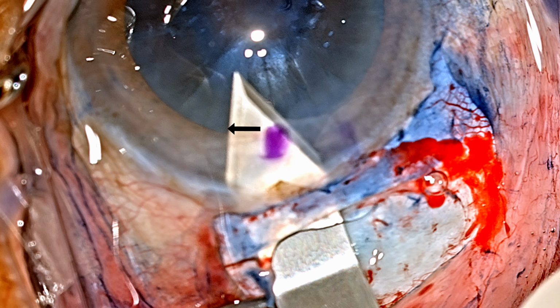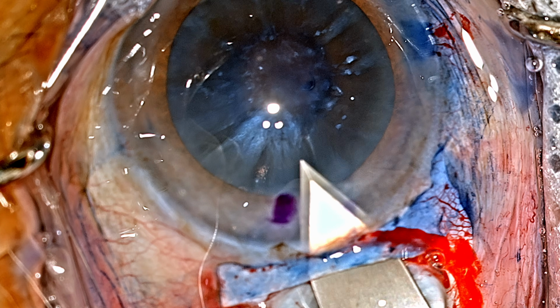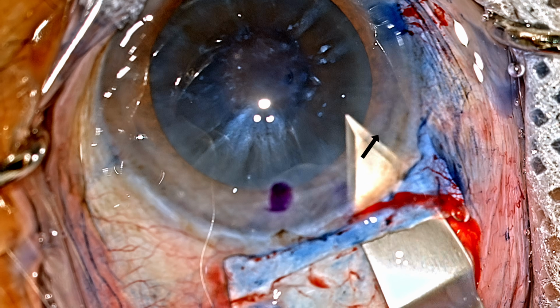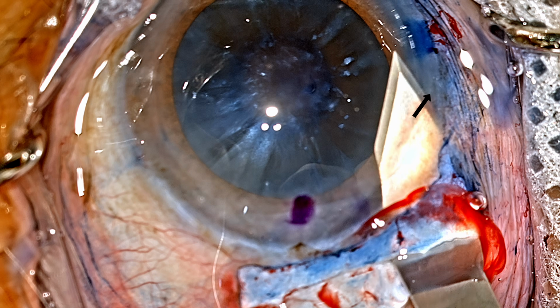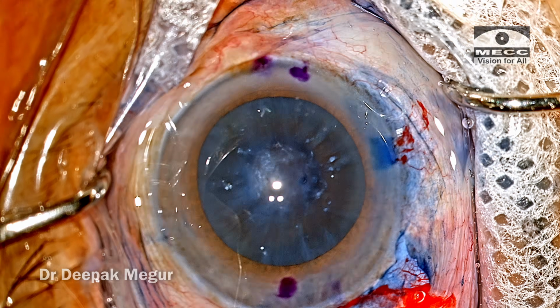While extending laterally, the edge of the blade is slightly tilted upwards as the extension of the internal lip is being done on either side. Now we have our internal lip, which is nicely done. Time to perform the rhexis.